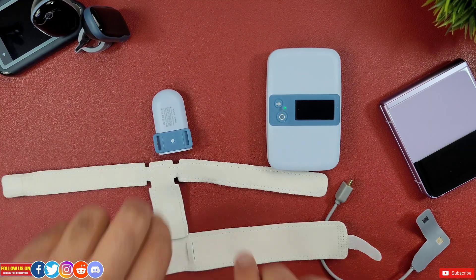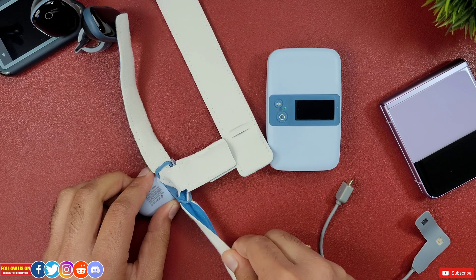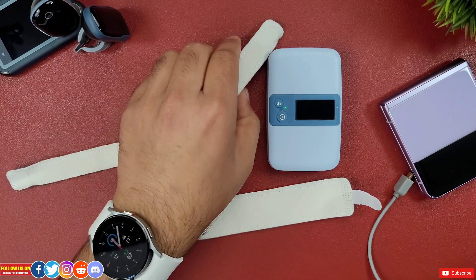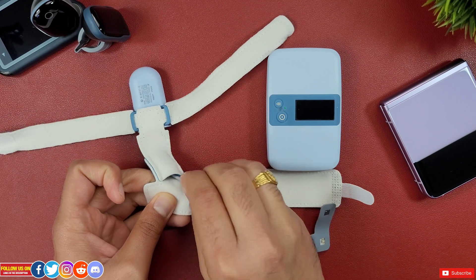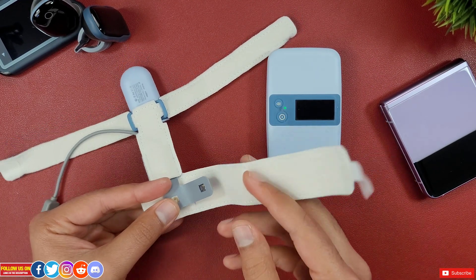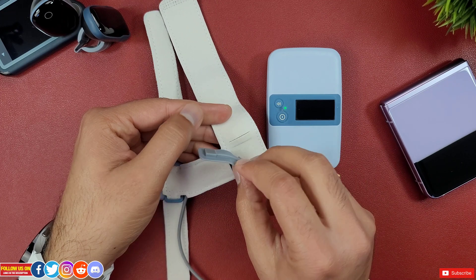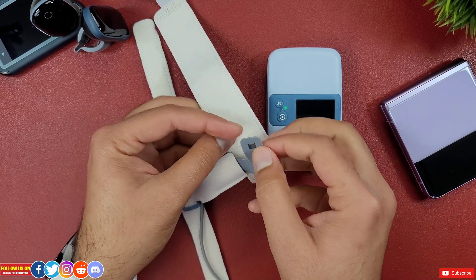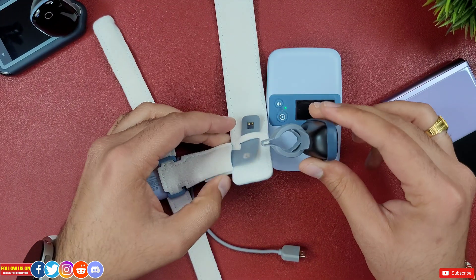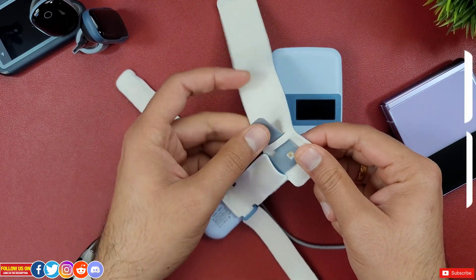Starting with split wrap installation: to make it easy, make sure the blue part of the strap is aligned to the display side. Slide the longer ankle strap through both loops of the device. Once installed, slide the L-shaped sensor through the foot strap by sliding the port into the split gap, then slide the part housing the sensor through the slit so that the light-emitting sensor and the light-detector sensor are facing you. If they face the other way, it won't detect. The idea behind this foot sensor versus a ring sensor is that ring sensors are too big for toddlers under three years of age.